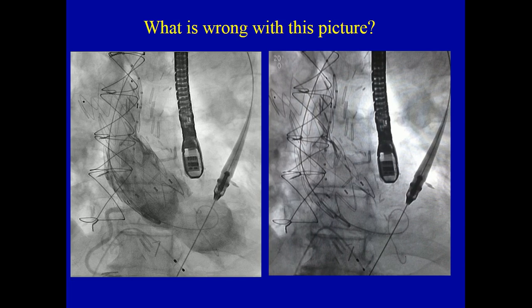And suddenly we get this image under RV pacing. Any idea what went wrong here? Look at the angiogram. So suddenly we have a significant aortic regurgitation on the root angiogram. And the anesthesiologist wakes up out of his sleep and says, wow, we have dropping hemodynamics. Now this patient has femoral access. I can switch him to the transfemoral access and go on pump.